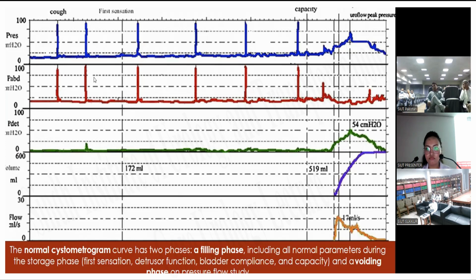Just going quickly because we have shortage of time. Just a point here, because one graph is actually missing, and that one is the volume graph. You see, the volume graph should have risen from 0 to whatever, 519, and then goes on.